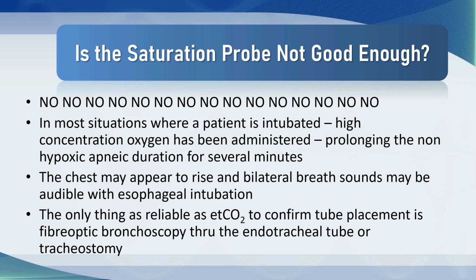Unless you can stick a bronchoscope straight down through that endotracheal tube to see the carina, and you're not going to do that very often, except perhaps if you're performing a tracheostomy, you must check end-tidal CO2. It is the only reliable measurement that we look at in anesthesiology and critical care.